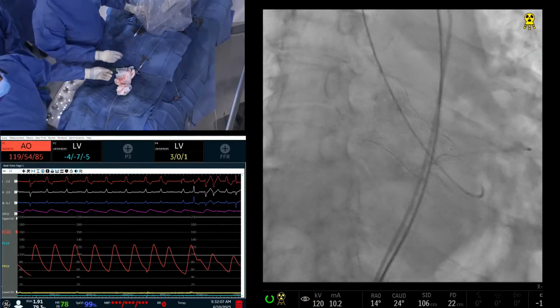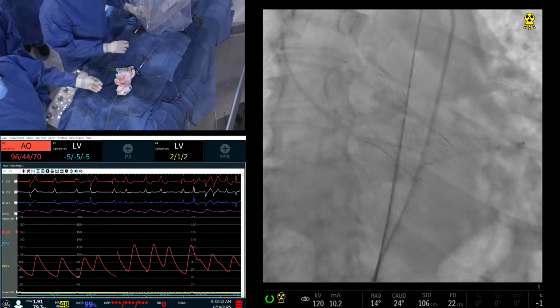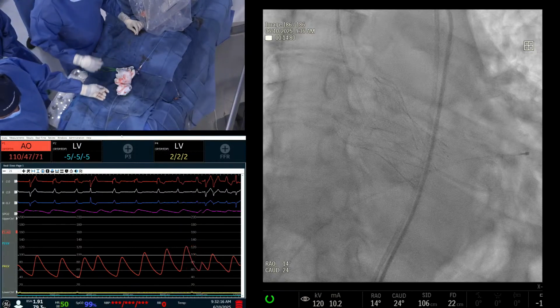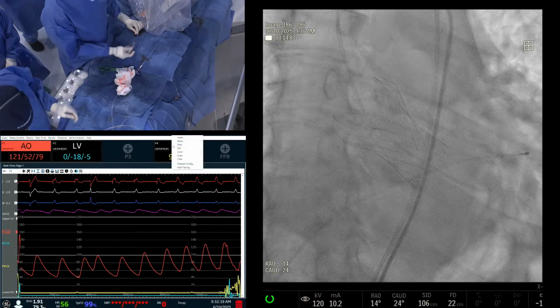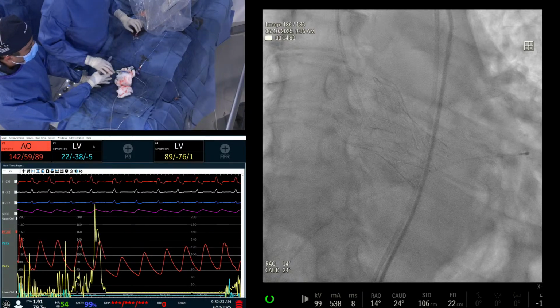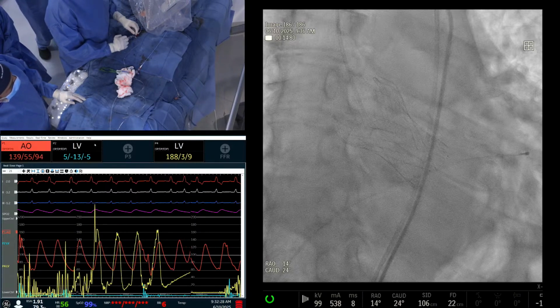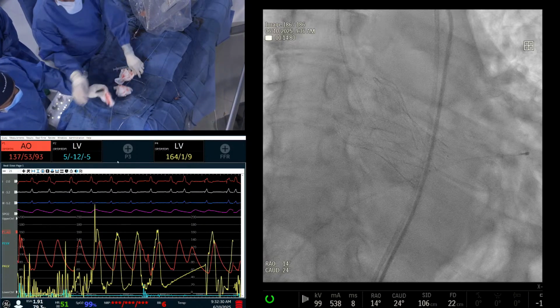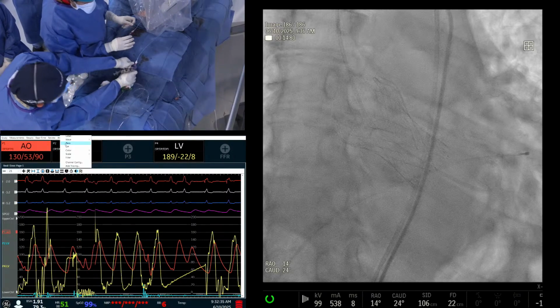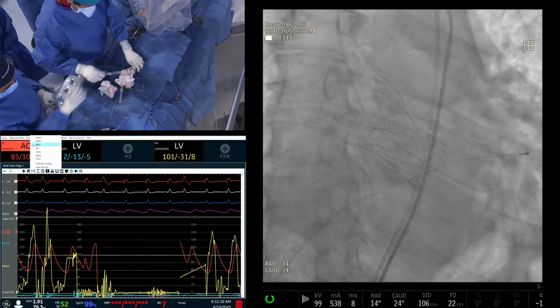So you saw the initial aortogram did not really have PVL, but this is frame under-expansion, and we now know from several papers that it is a precursor for HALT, valve failure and even mortality. So in patients, we are being proactive, because we don't know if this patient will live to 95 years old. That's 15 years from now. So we need to make sure the valve will last. Forget about CAD progression, because there's a recent paper showing that CAD progression after aortic valve stenosis is actually quite low. It's more the valve durability that's the concern.